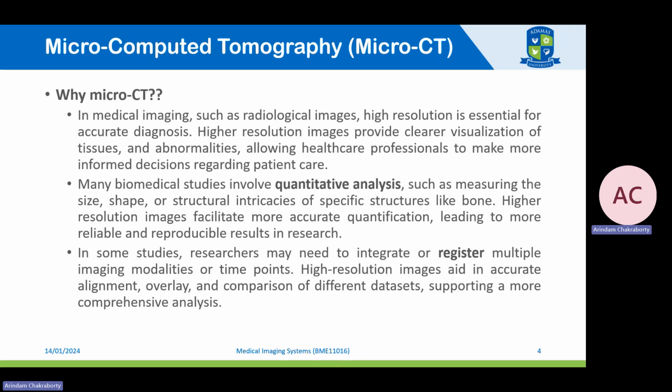In some other cases, researchers or clinicians may need to integrate, or what we call image registration, that is, register multiple images at different time points, or images of the same structure or the same organ tissue using different imaging modalities, to extract more information from it. This sort of image registration is sometimes of utmost importance when we try to understand the growth of, let's suppose, a tumor or a bone growth after introducing a typical design of biomaterials inside the living system.